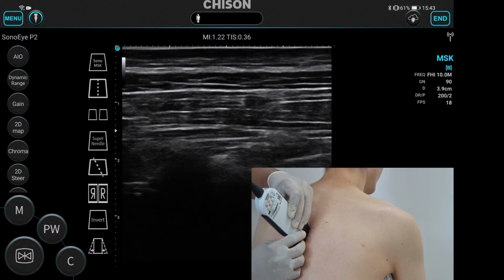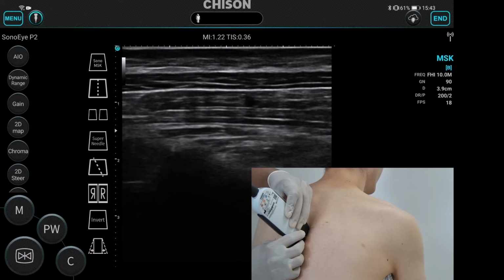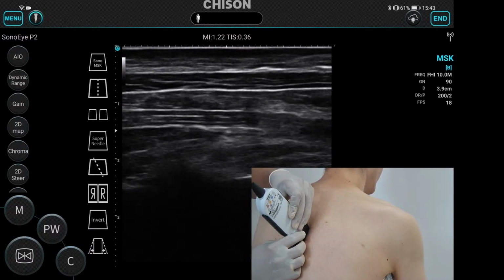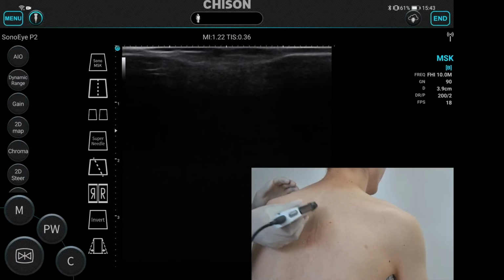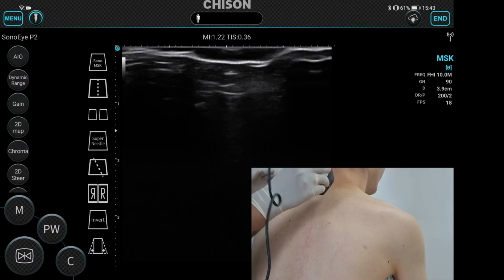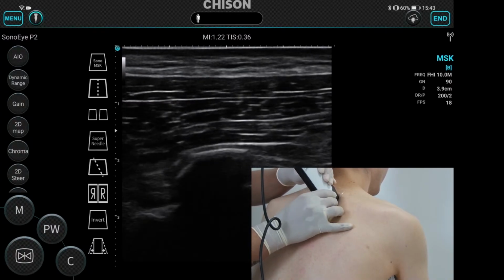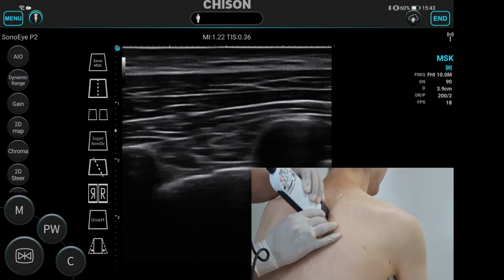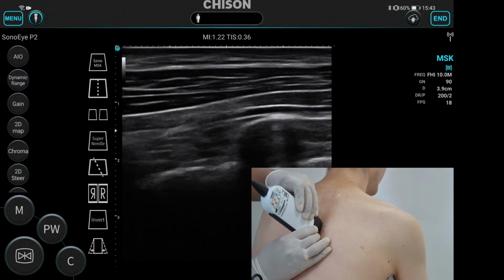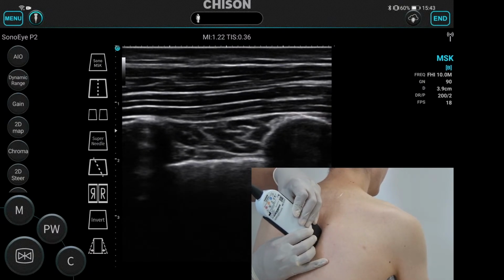Now if you see, we have three muscle groups in the picture. We have trapezius, we have rhomboid, and we have the erector spinae muscle. Now go back. So where to use this? This is mostly used at the level of T5. So you can always try to scan from here. We can see the first, second, third, fourth, and fifth. Somewhere over here, fifth.